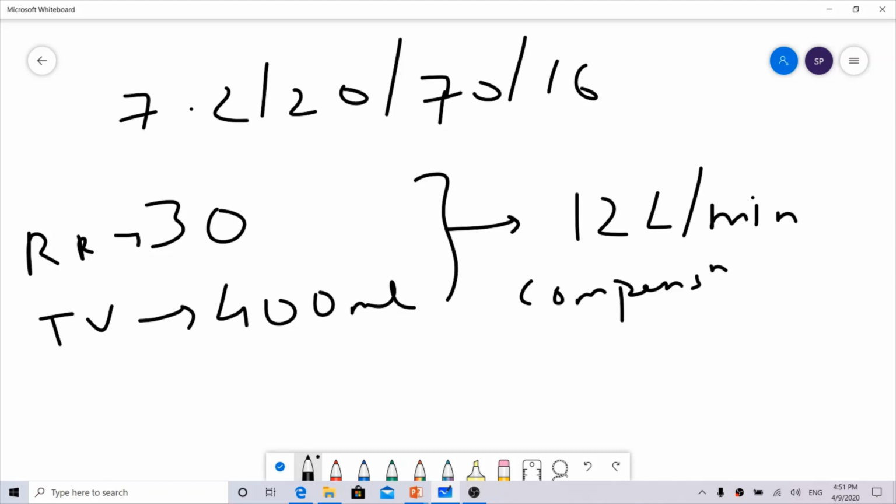Now you find you need to intubate this patient, because the saturation is not very good. You just keep settings, let's say, at AC, a rate of 12 and a tidal volume of 500.